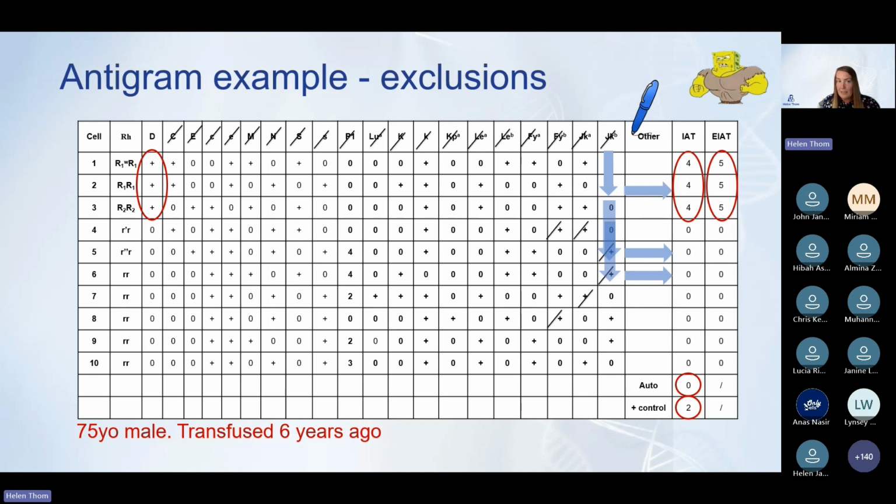Now what I'm looking at is I've gone to the end and I can't exclude D. So now I'm going into inclusion territory where I'm thinking, hang on, this is really looking like an anti-D. Using my grading and my knowledge of how antibodies behave, whether they're papain sensitive or enhanced by papain, in this case Rh antibodies are. If you want to know which are, you can check your BSH guidelines, or it might be incorporated in your local SOPs.